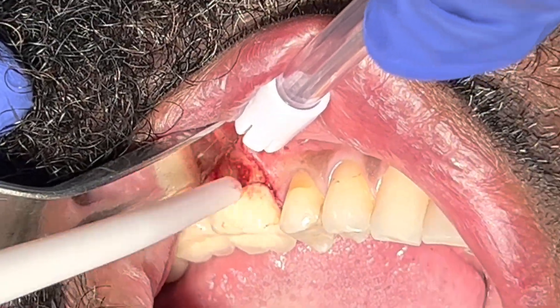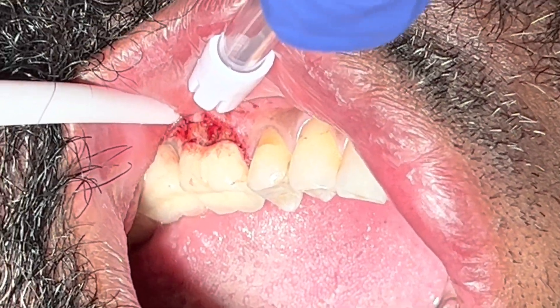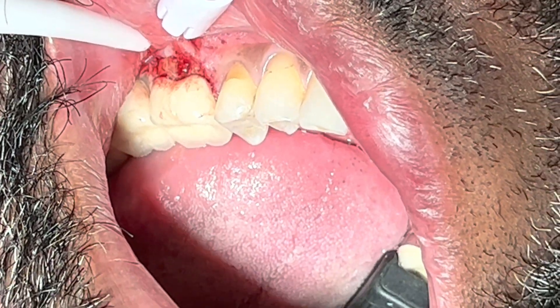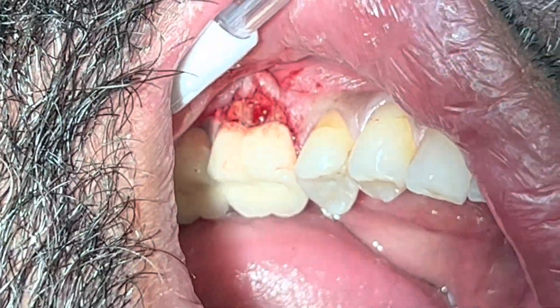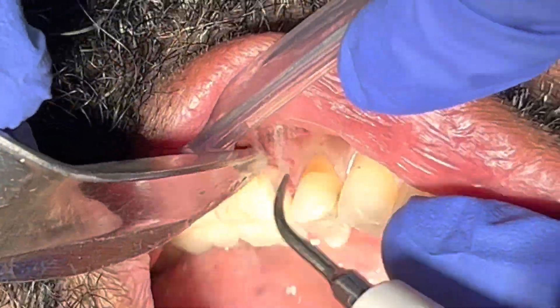I could have released the mesial aspect as well, but I don't think that's a good idea if we're trying to graft the area and be more predictable with primary closure. So I release only one side — that's a trick for deciding how to open the flap.